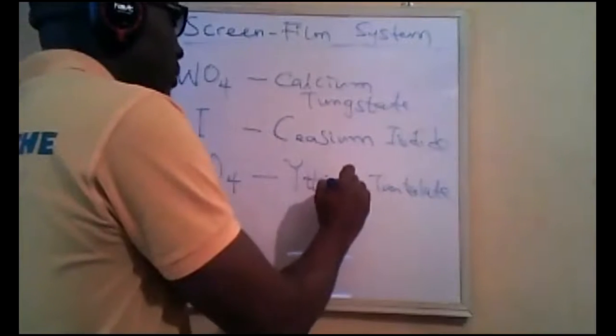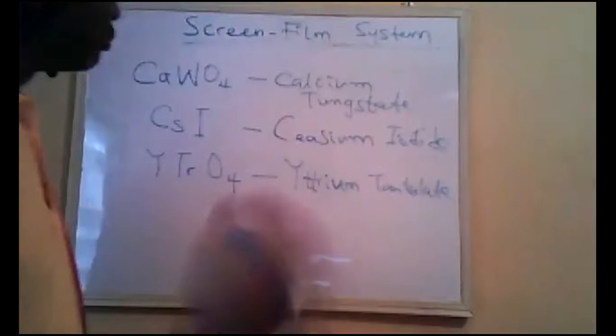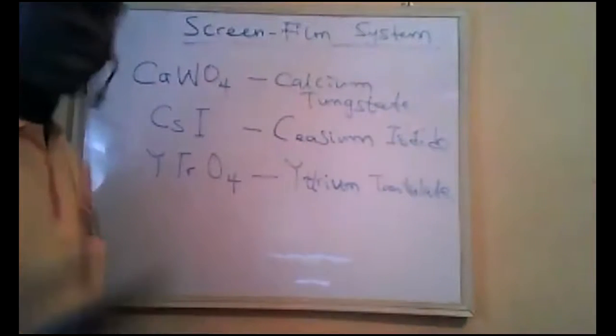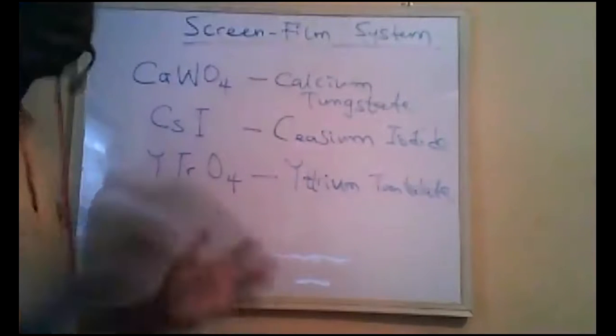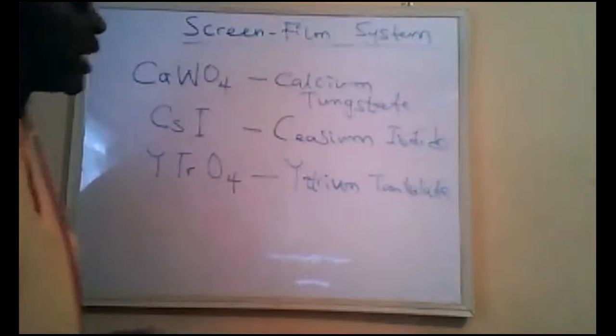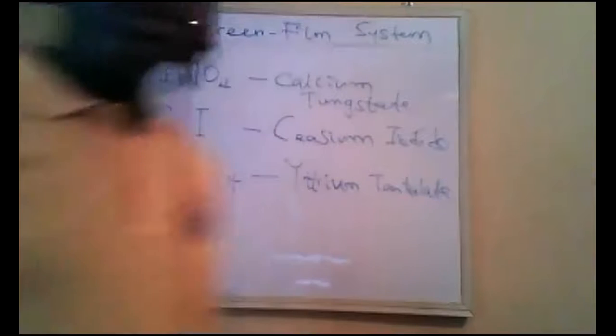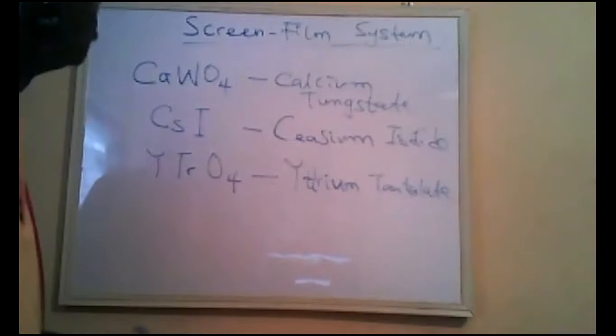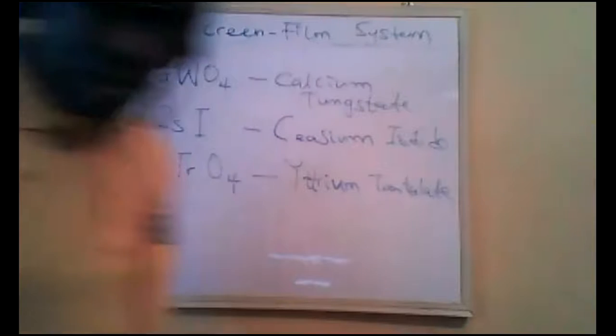Of course, through research, so many things have gone into coming to the moment where we are, in which we use gadolinium oxysulfide. So this is also an example of a phosphor.